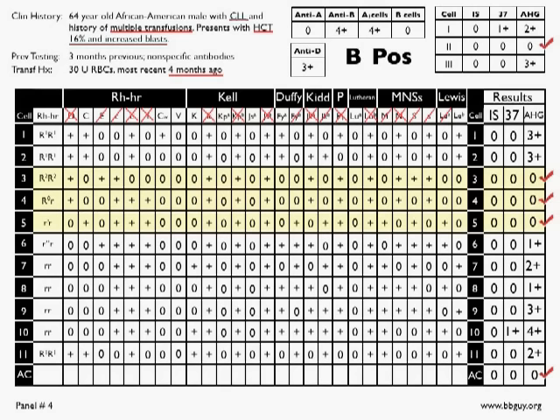Here's what you could rule out, and you only have 3 completely negative cells, so not surprisingly, you have a decent number of antibodies that you can't rule out with at least one double dose crossout. But again, if you take away the ones that aren't particularly high risk, and you notice on the far right, we have anti-Lewis B, which you can't rule out, but to have an anti-Lewis B that does not react at immediate spin or 37 would be shocking. So it's highly unlikely it's an anti-Lewis B.